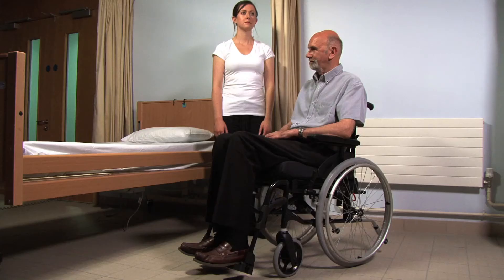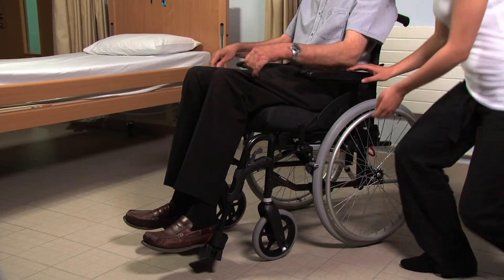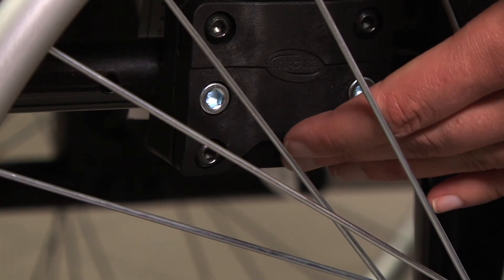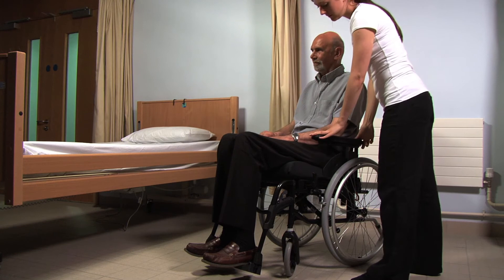The handles at the back of the wheelchair allow the caregiver to assist with moving the chair where necessary. The armrests at the side of the wheelchair can be removed by detaching them at the front and back of the chair. To reattach, fit them back into the frame and click into place.